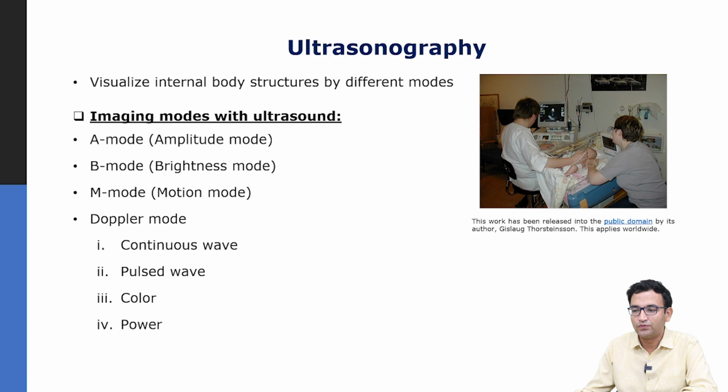receive. So, first the simplest one is A mode, in which you send a single RF line, and when you get back the echoes you take the envelope, and that actually localizes the presence of the strong scatterers. And this A mode imaging is now very uncommon in diagnostic ultrasound imaging, but it is still very extensively used in non-destructive testing for looking at structures, beams, aircraft wings, railway tracks, etc., where mechanically scanned A mode is very common.